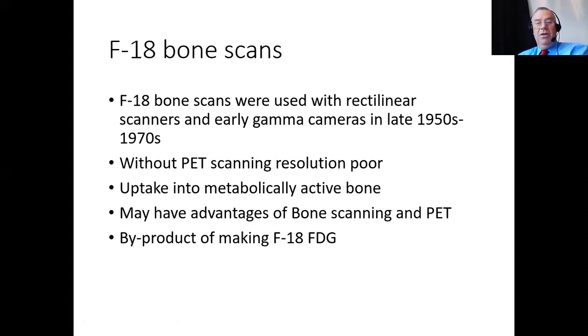Just to finish off a little bit on F18 bone scans. F18 bones were used for rectilinear scanners in the late 50s to 70s.